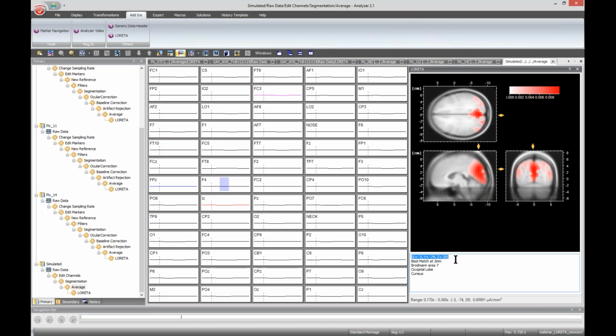Okay, now I will move on to the final question. How is the source localization affected by removing noisy channels in advance, thereby also amounting to a smaller number of electrodes, which is less than 64?